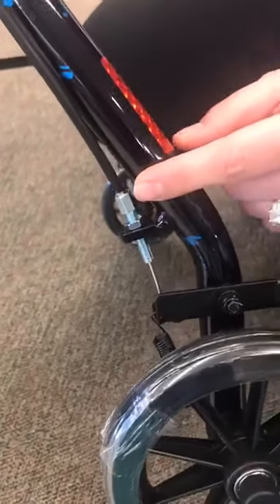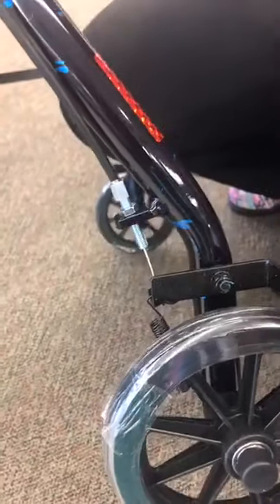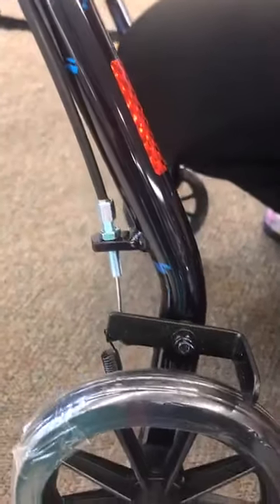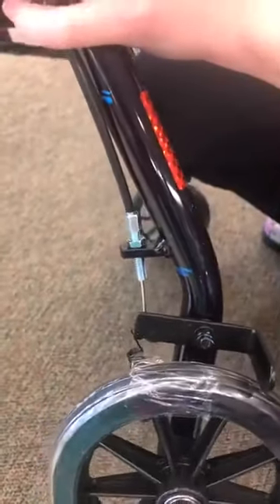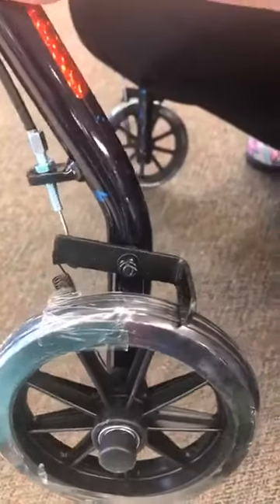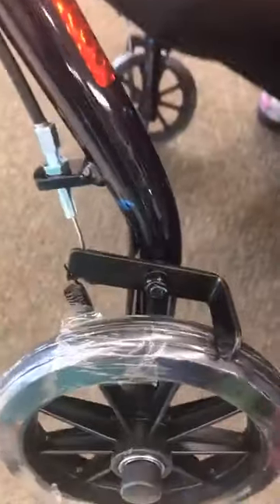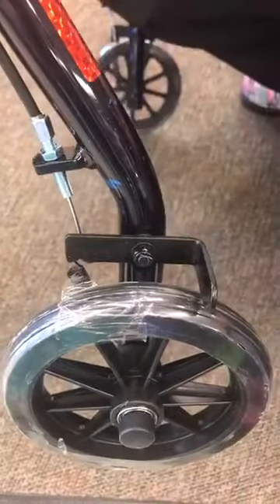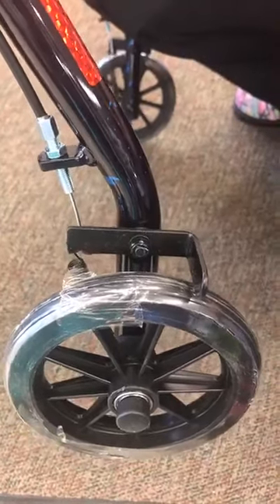Now when you're doing this, you just want to tighten it just a little bit at a time. You don't want to over tighten them, or you don't want to make them too loose to where your brakes aren't taking. So right now, if you watch this brake pad right here, you see how it's going up and down? I'm putting the brakes on and taking them off. So if that ever becomes sluggish, you can make that adjustment on this bolt right here, and that'll tighten them up for you.